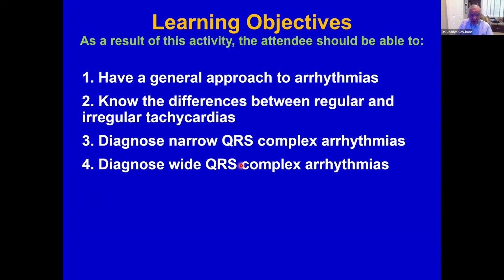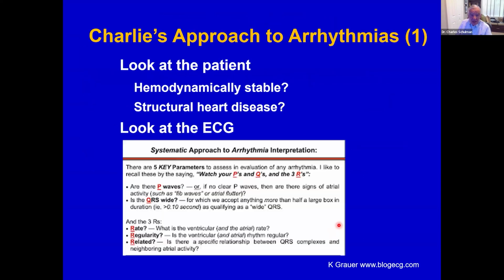So the learning objectives are that you have a general approach to arrhythmias, which we'll talk about, to know the differences between regular and irregular tachycardias, to diagnose narrow complex tachycardias as well as wide complex tachycardias.